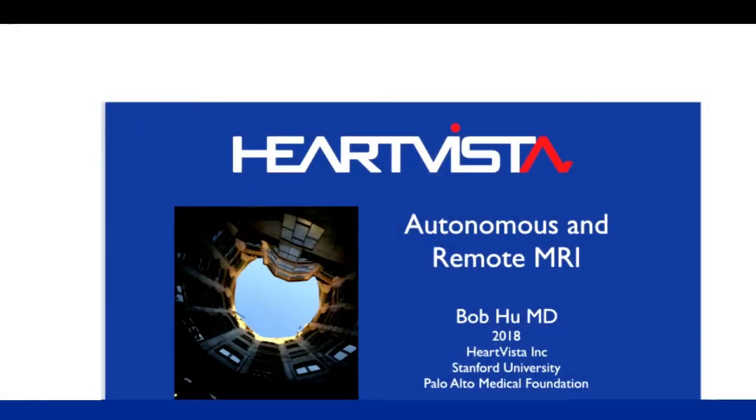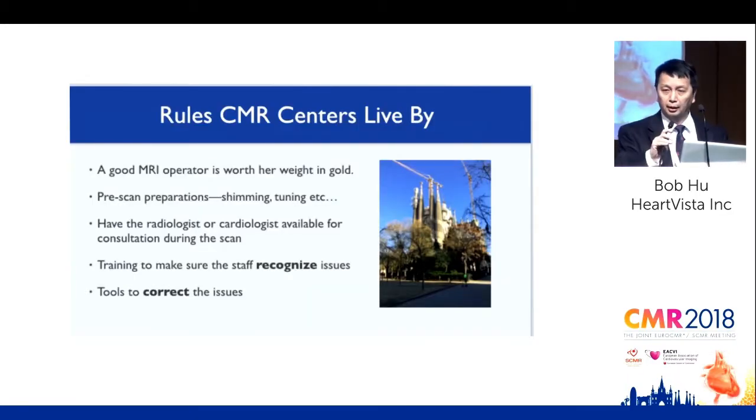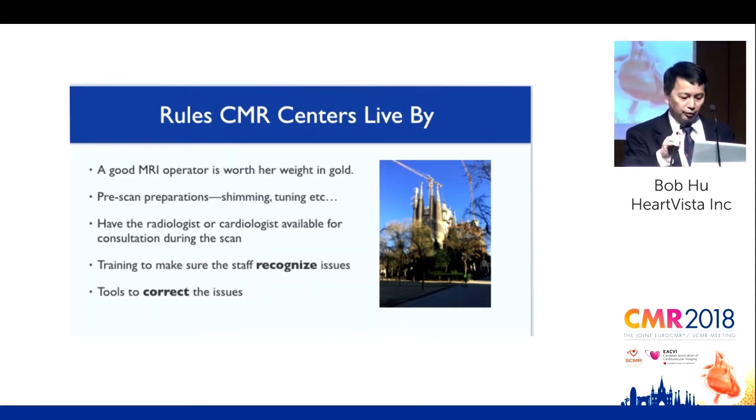What I'd like to talk about is autonomous and remote MRI. And the idea here is quite simple. We believe that cardiac MRI today is done in a difficult way, and as many of the previous speakers already mentioned, takes too long, and the preparation is difficult.